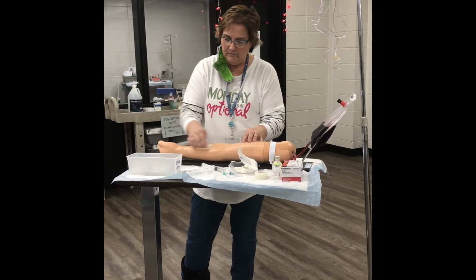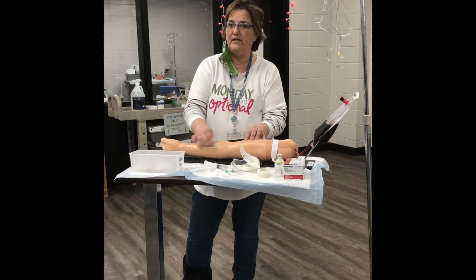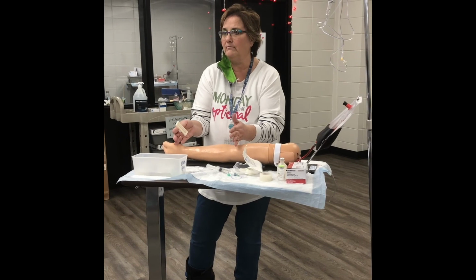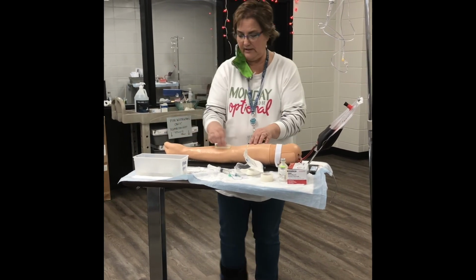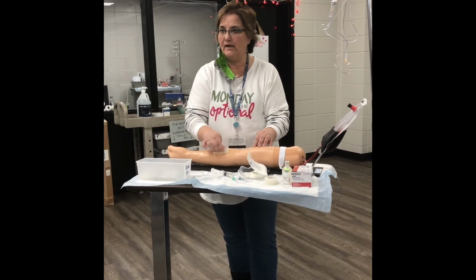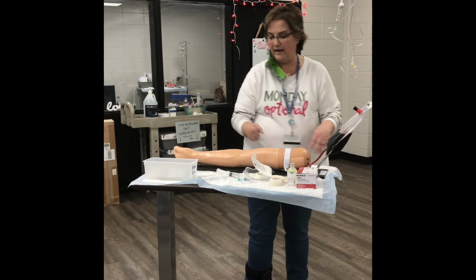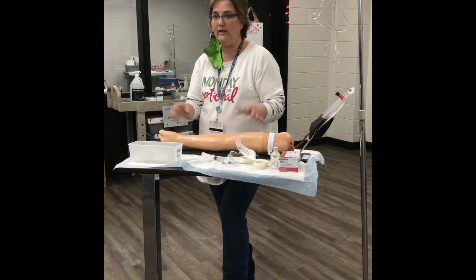All right, now you want to clean a big enough area that you're certain you're going to stick where you've cleaned, but I can't clean the whole forearm just to be safe, so just clean your area. You're supposed to do it for about 30 seconds. It's back and forth, all right, so you've done that. Then while that's drying, we can get everything ready.